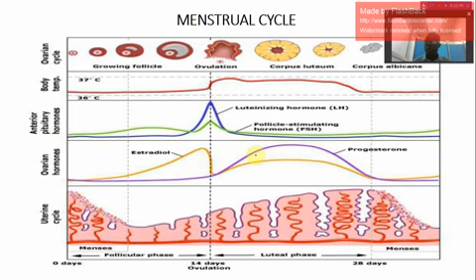In the luteal phase, the endometrium becomes thickened. That is the secretory phase. And this is the menstrual to proliferative phase. That's when the estrogen rate comes higher in the bloodstream. Then after that, it reduces to a lower level, then later rises again during ovulation.